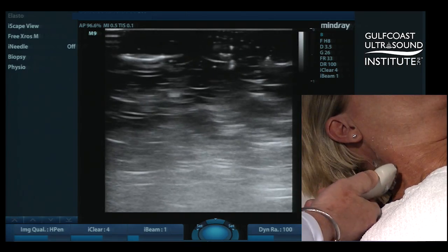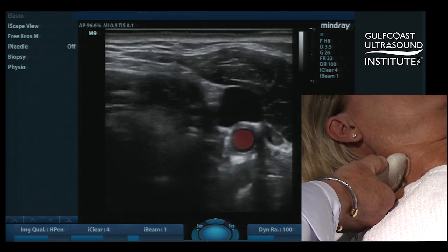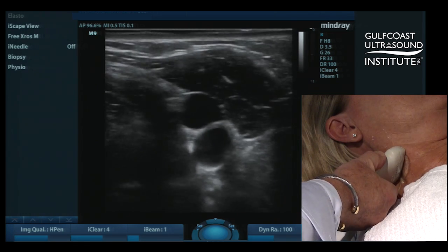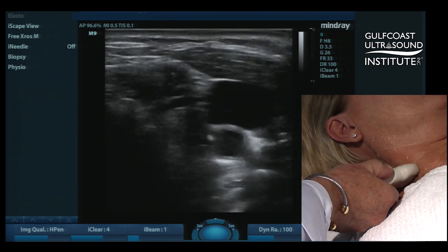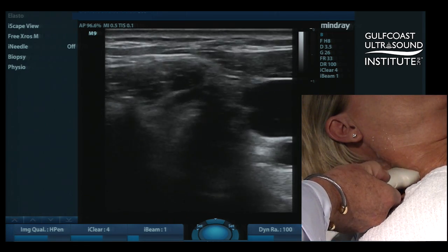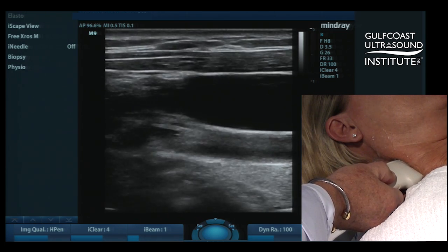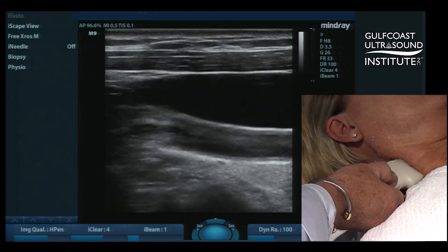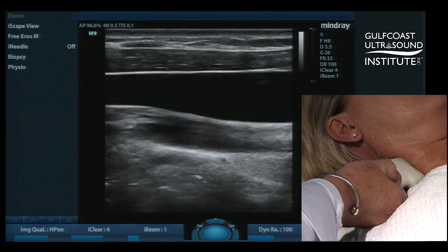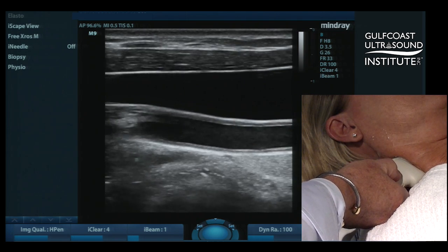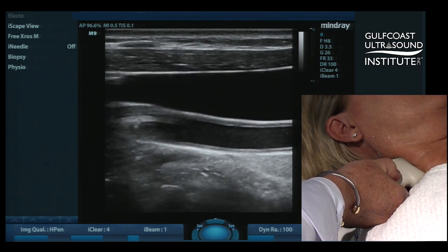Basically, come in the cross-section view of the neck, identify the common carotid artery, center it on the screen, swing into long axis, get a good long axis view of the distal common carotid artery, showing as clearly as possible the intima-media layer along the far wall.